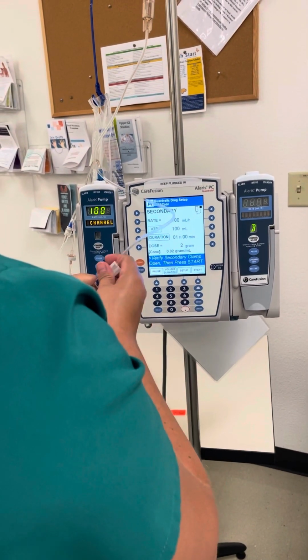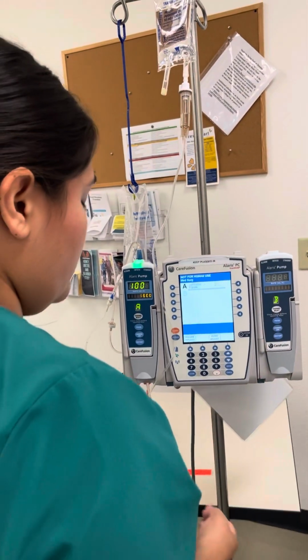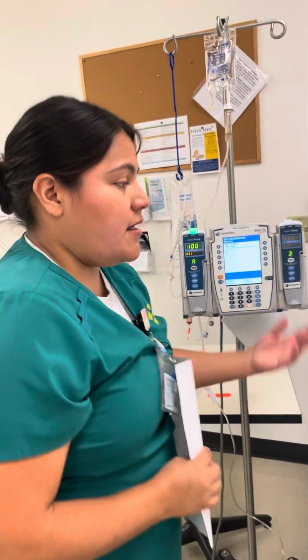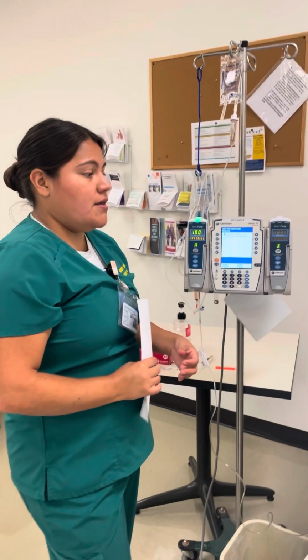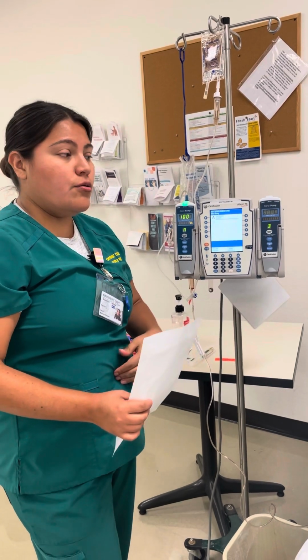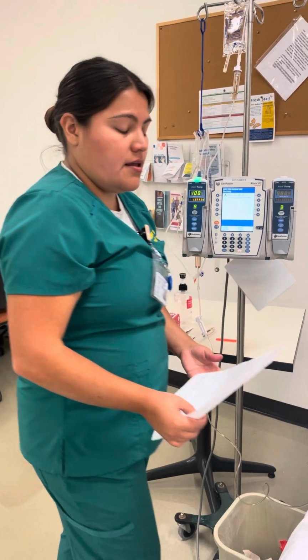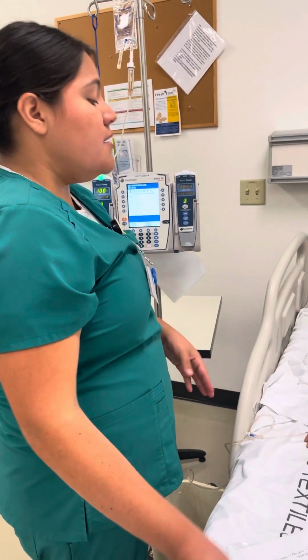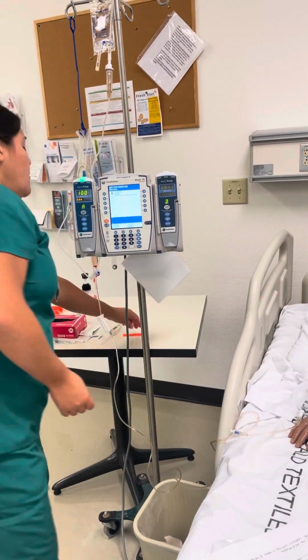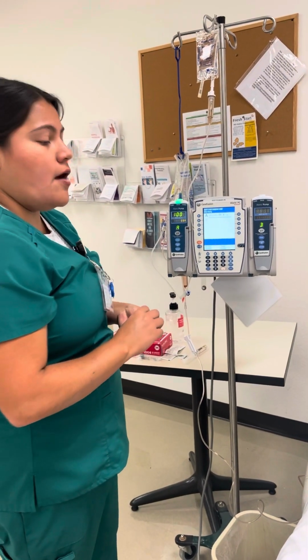I'm going to start it. Make sure I have the first drop and explain part of the adverse effects. The symptoms can be urticaria or diarrhea or vomiting. If the patient presents any of those, you can let me know. And I'm also checking that there is no discomfort. I'm also labeling the tubing that is good for 96 hours.